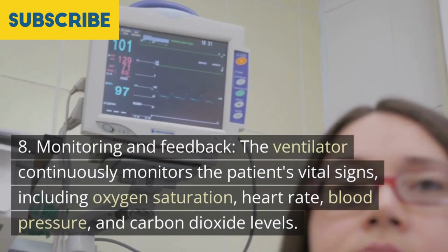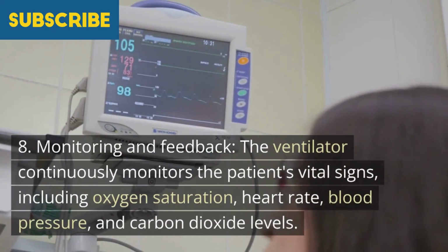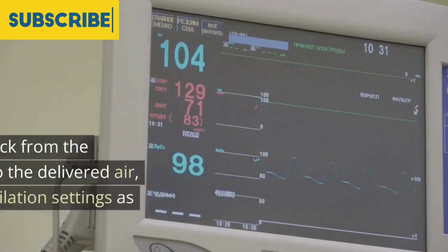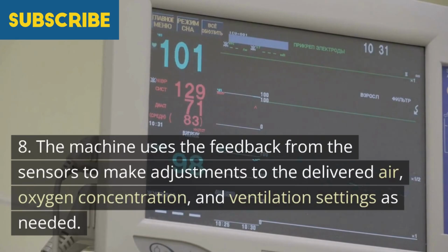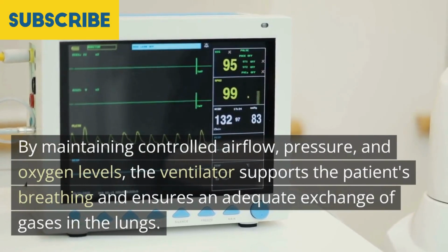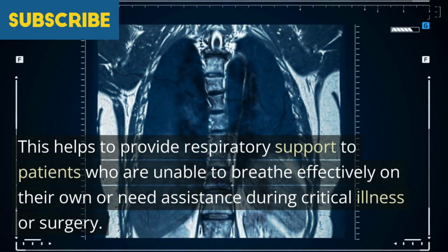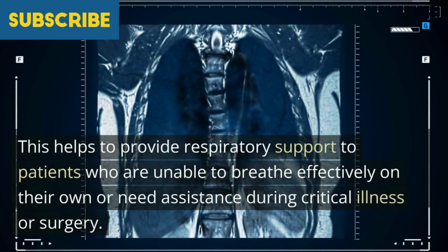8. Monitoring and feedback. The ventilator continuously monitors the patient's vital signs, including oxygen saturation, heart rate, blood pressure, and carbon dioxide levels. The machine uses the feedback from the sensors to make adjustments to the delivered air, oxygen concentration, and ventilation settings as needed. By maintaining controlled airflow, pressure, and oxygen levels, the ventilator supports the patient's breathing and ensures an adequate exchange of gases in the lungs. This helps to provide respiratory support to patients who are unable to breathe effectively on their own or need assistance during critical illness or surgery.